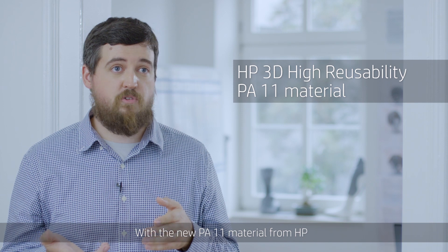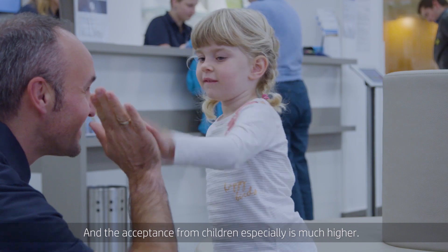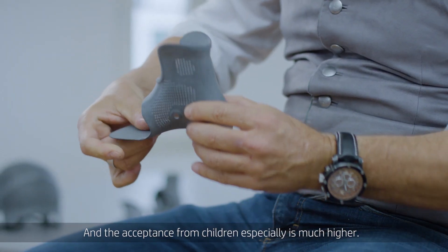With the new PA 11 material from HP, we can get a fantastic flexibility into our products, and the acceptance from children especially is much higher.